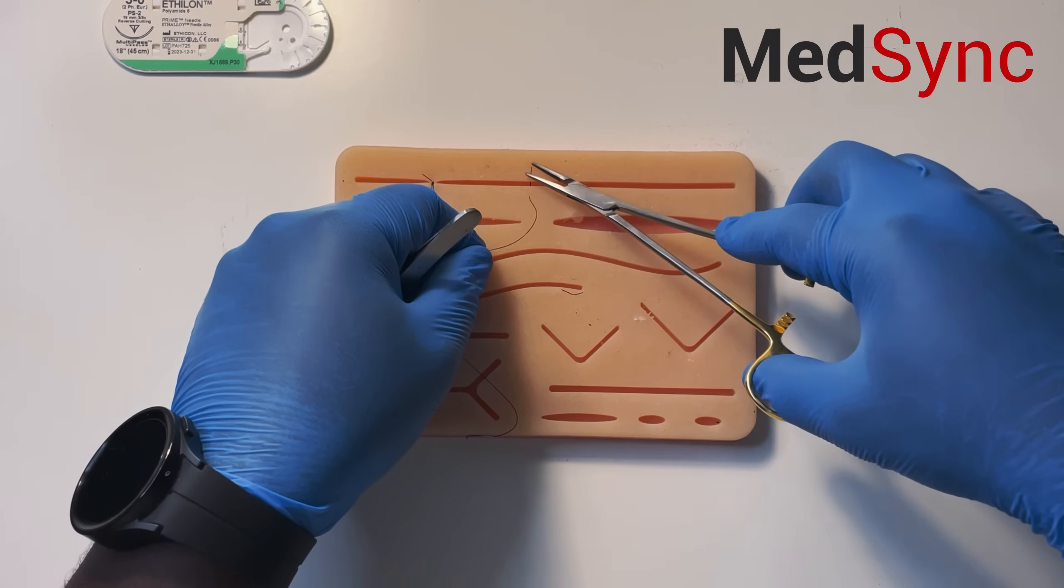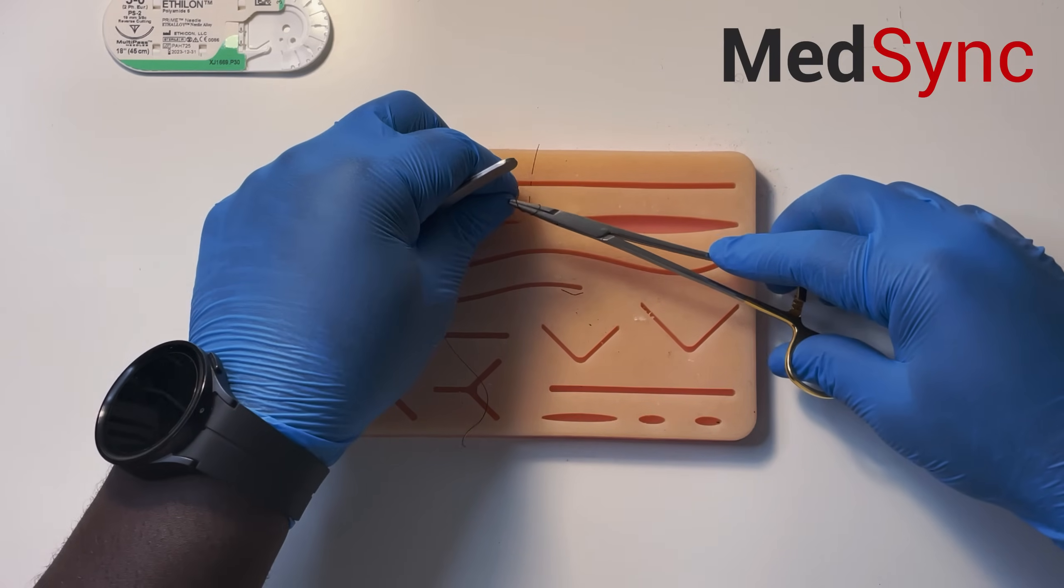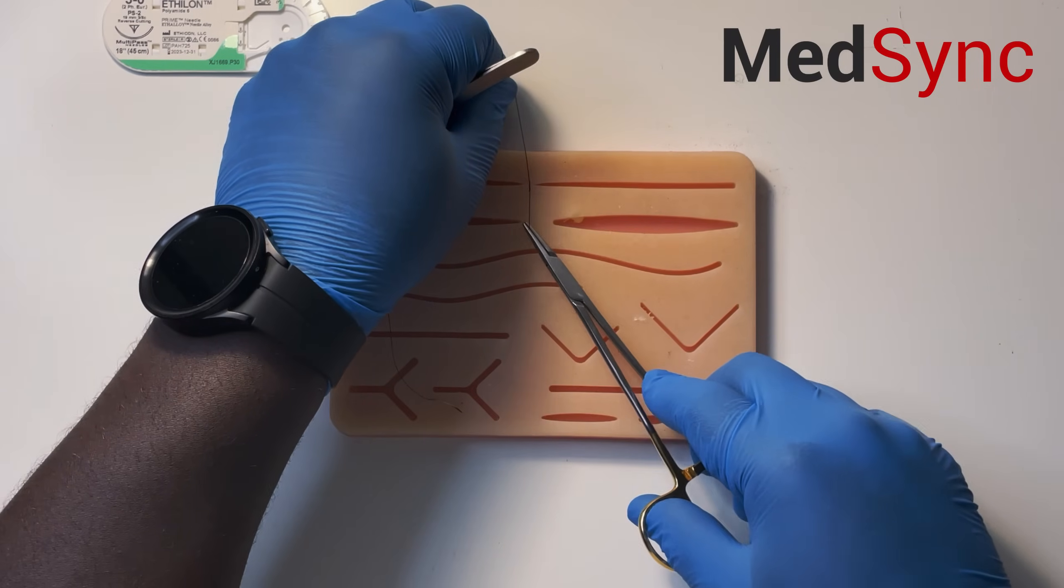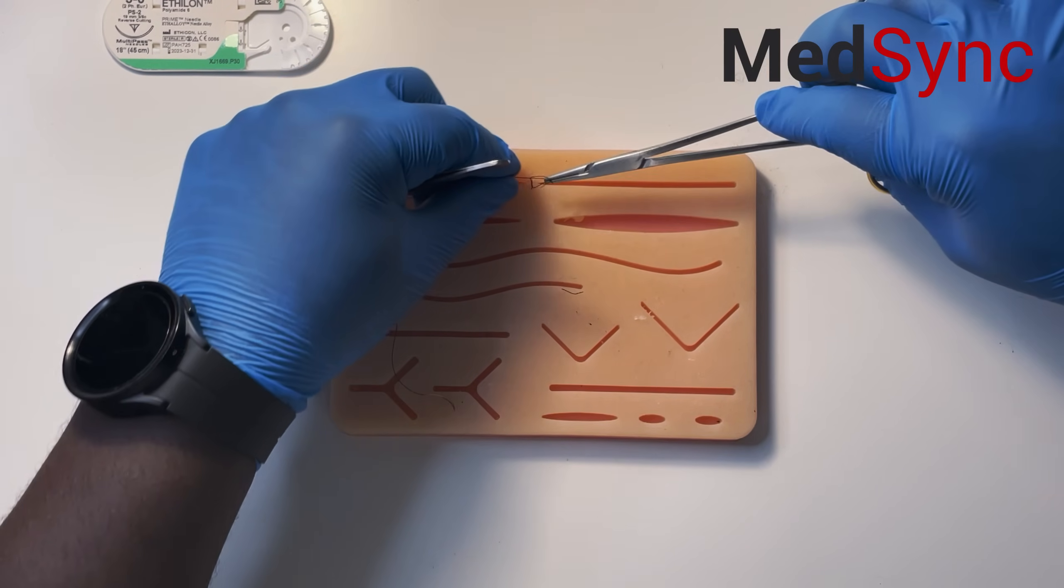You've only got a short end of suture. You push the suture forward to tie around the tips of the needle holder. Your suture ends alternate. You grab the very tip of the suture.